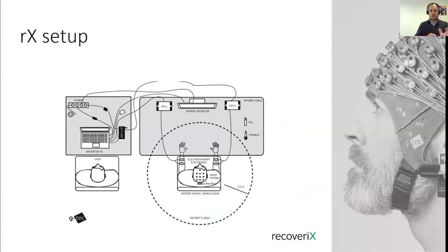So let's go to the right side of the figure. We have the patient seated on this chair. This diagram shows the arm therapy, so left hand versus right hand. But we can also deliver the therapy to the foot, to the ankle. In this case, we are treating the paralytic ankle against the healthy arm. So the diagram is a bit different, but essentially has the same components.